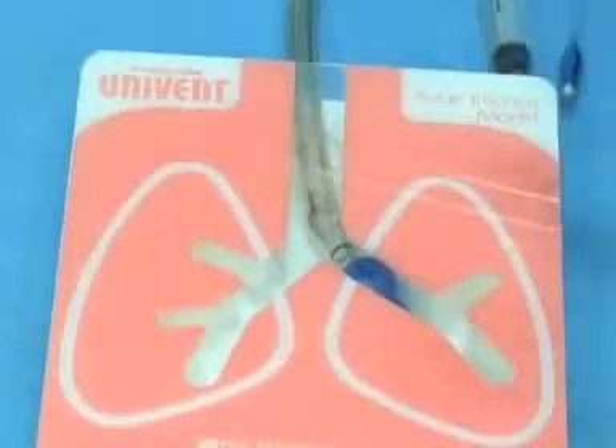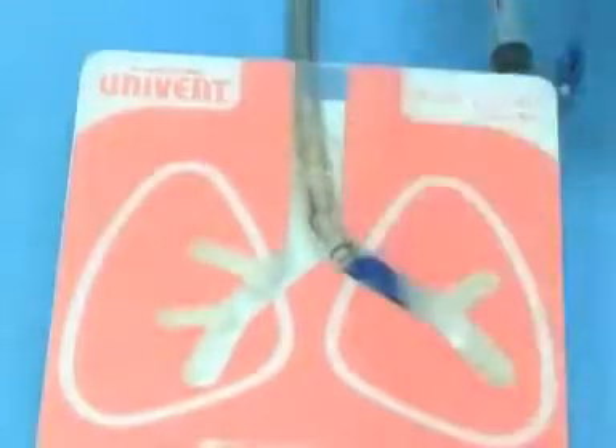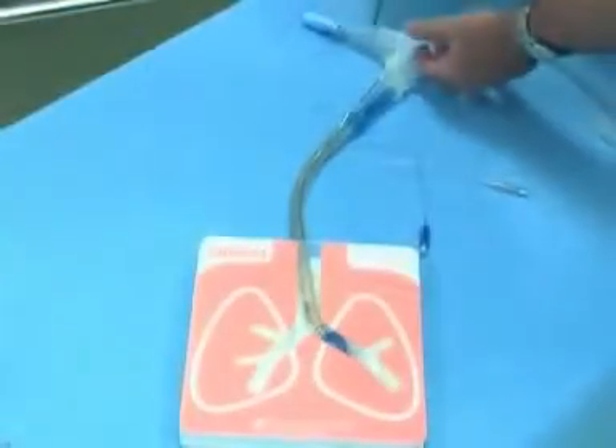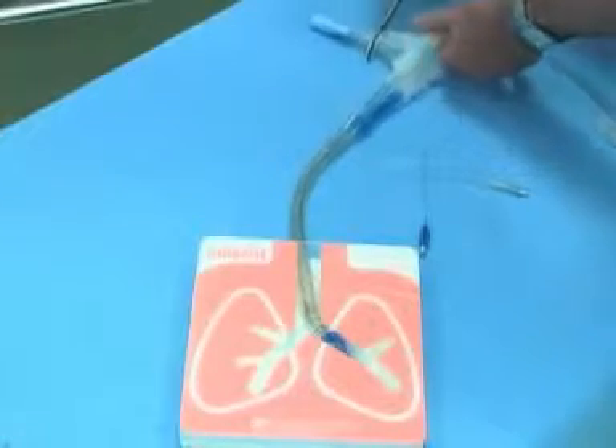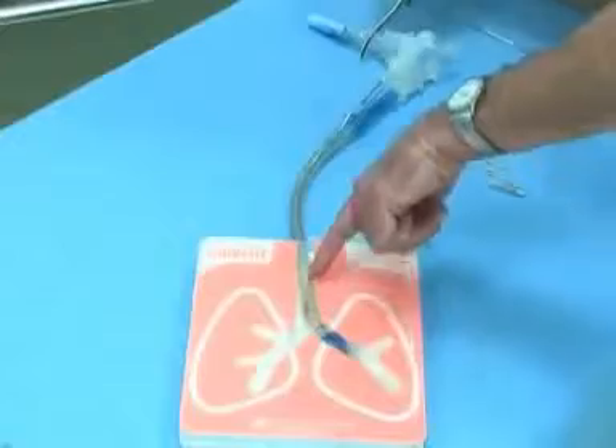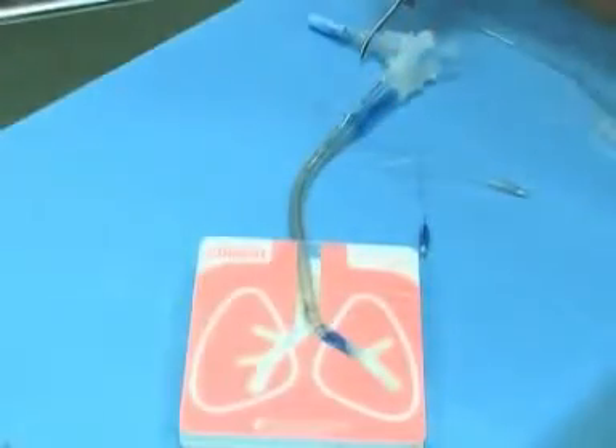Now that we've done that, we want to ventilate the patient after all. One thing you want to make sure you do is clamp in the correct place. If we want to isolate the right side — clamp off and not ventilate the right side — we would clamp here, then open this, and that allows air to escape from the right side out so the lung can collapse, which will help the surgeon.